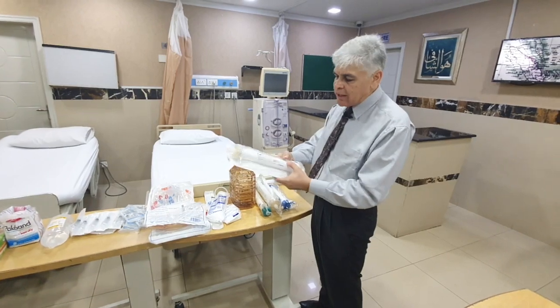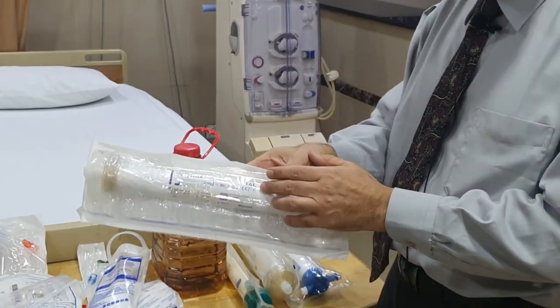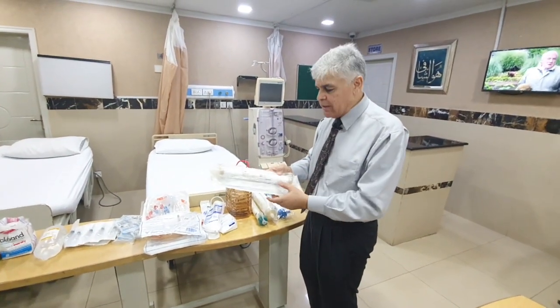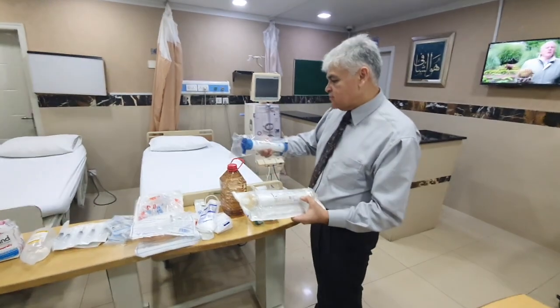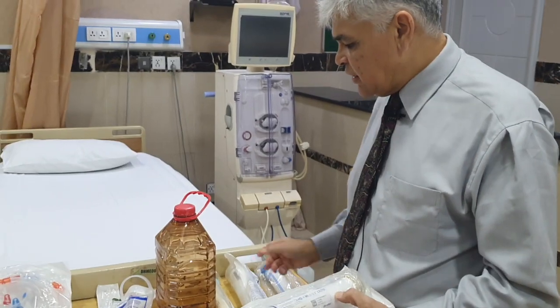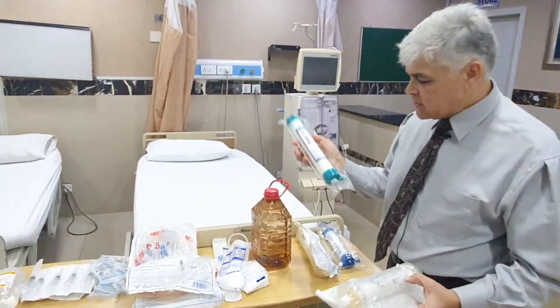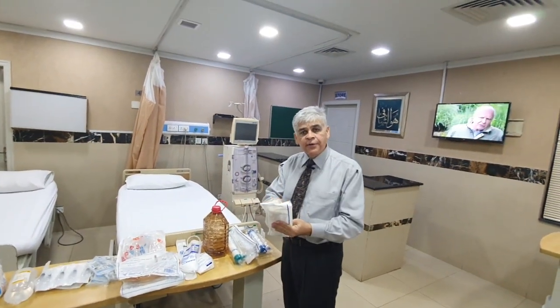You want to use it for a short while, but these ones are, for example, for younger patients, for people who are elderly and petite. You don't really want huge amounts of clearance. You just want a bit of clearance, and so you can use these ones. As I've said, these are different ones. They have an FX10 dialyzer, so they are different kinds. So this is a 1.8 dialyzer, a larger surface area dialyzer. If they've got a larger surface area, either they'll be big in width, or they'll be a bit higher.